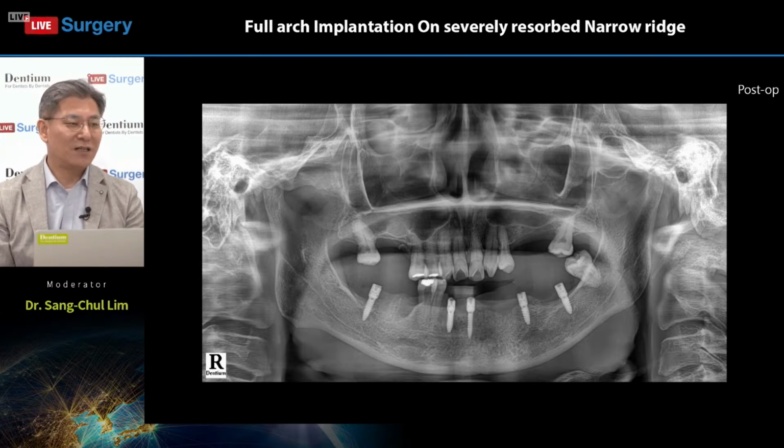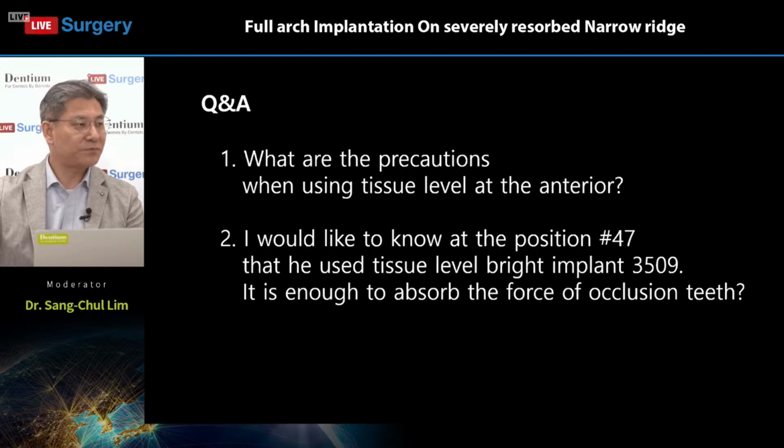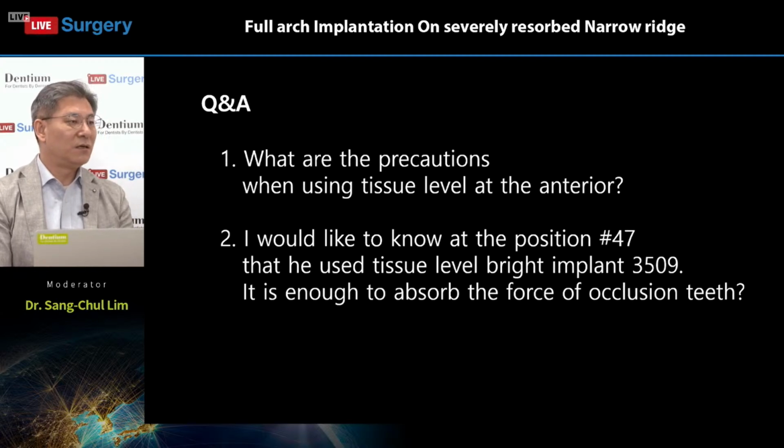So I deeply appreciate Dr. Chung once again. Okay, so let's take the Q&A session. Let's take a Q&A from overseas doctors. First one, what are the precautions when using tissue level at the anterior?